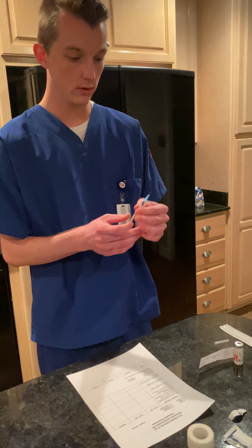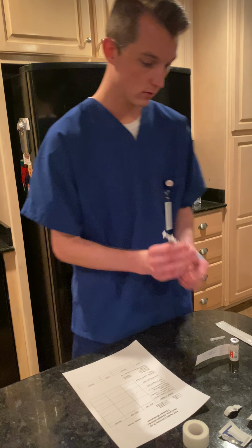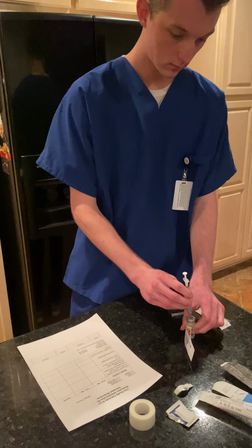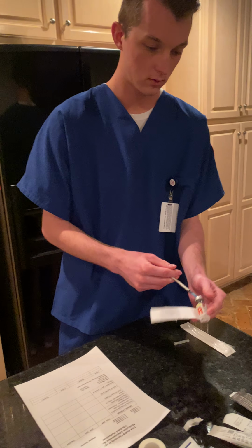So I'll pull 10 units of air into the syringe, and inject the air into the vial, and pull 10 units of insulin.